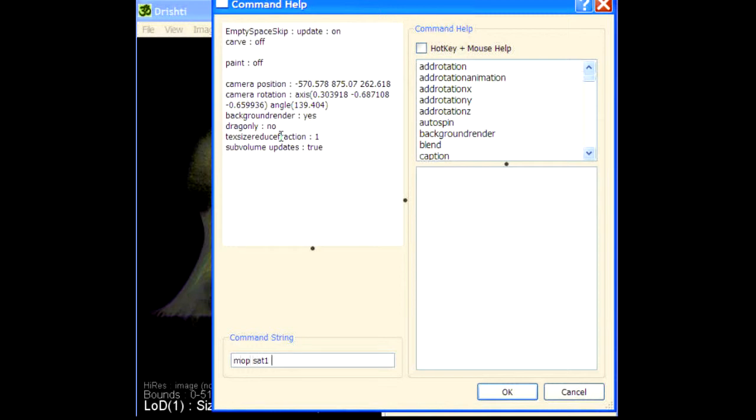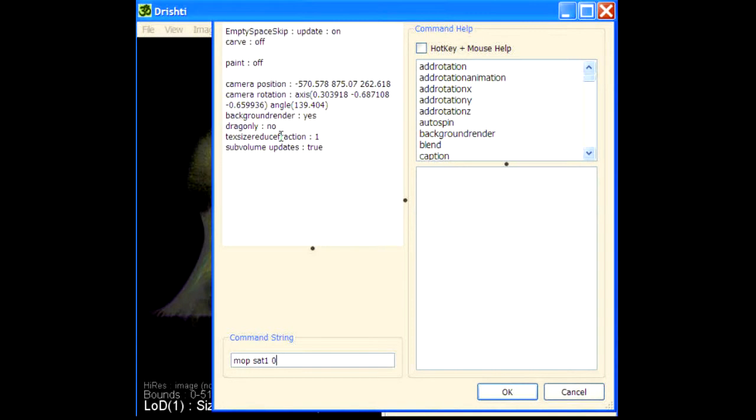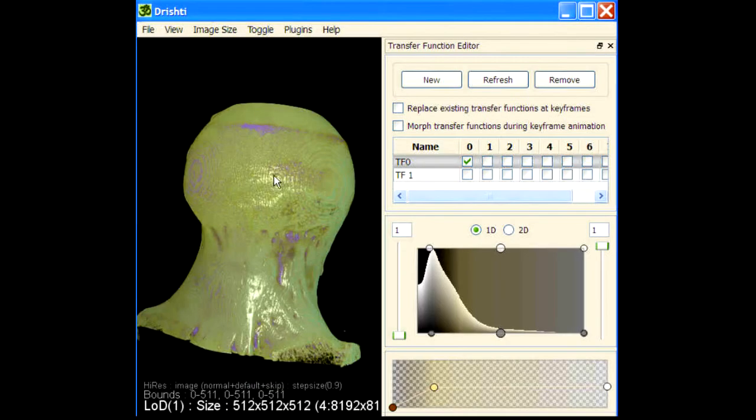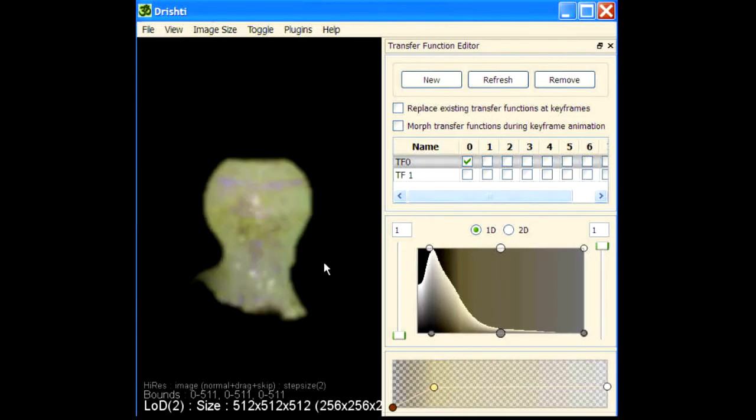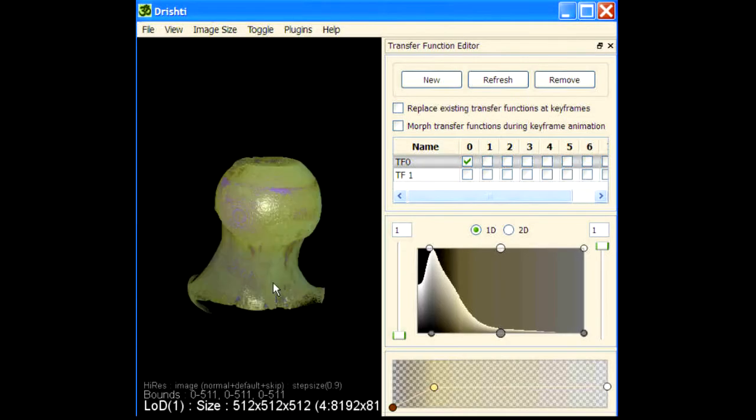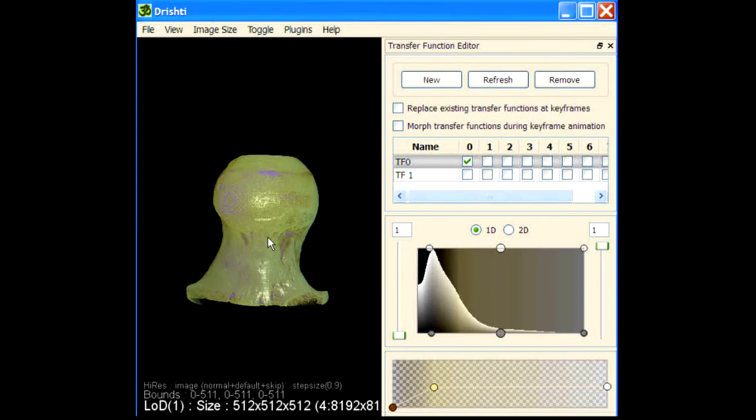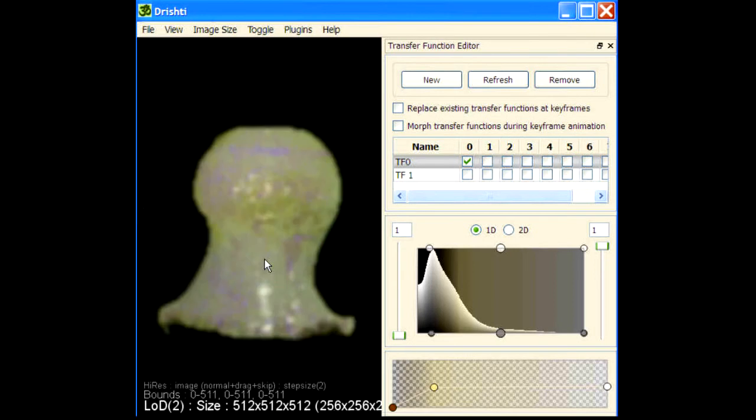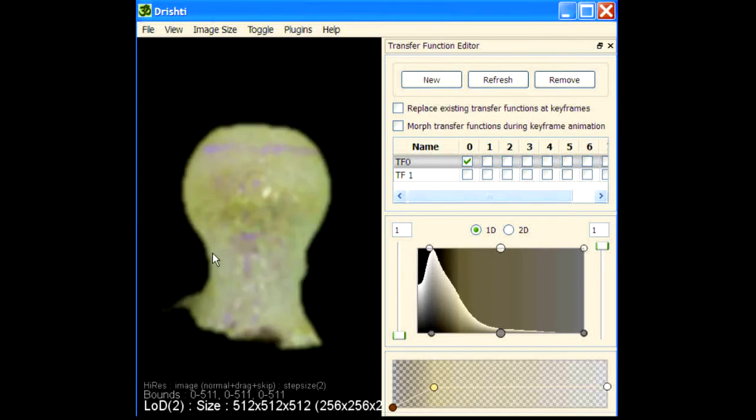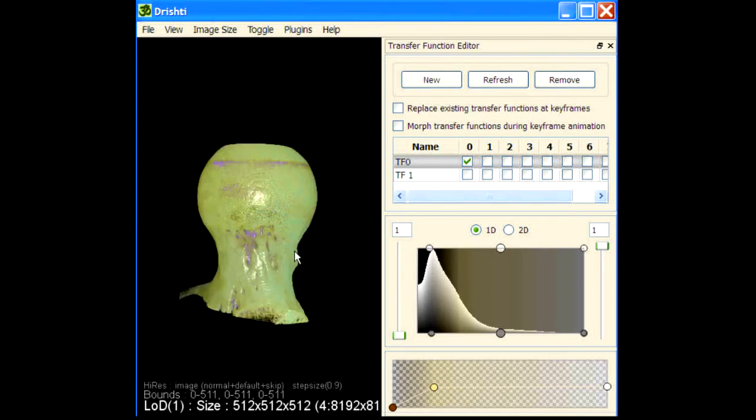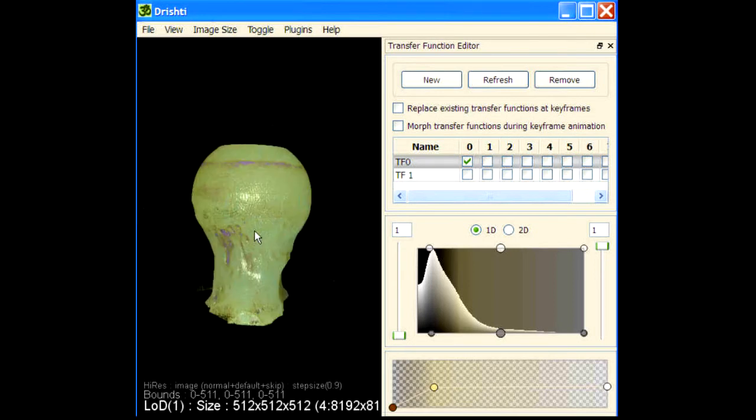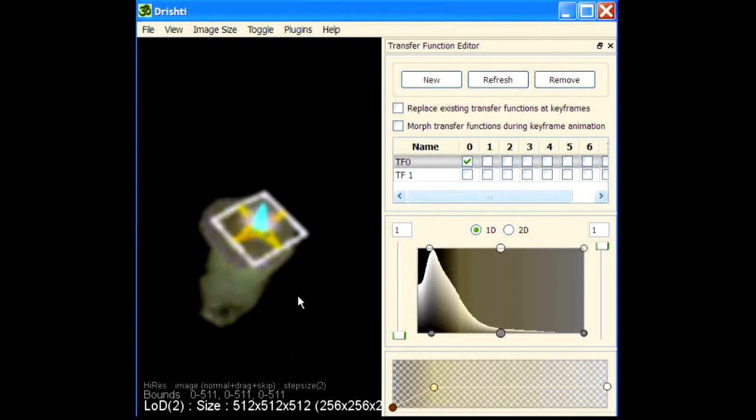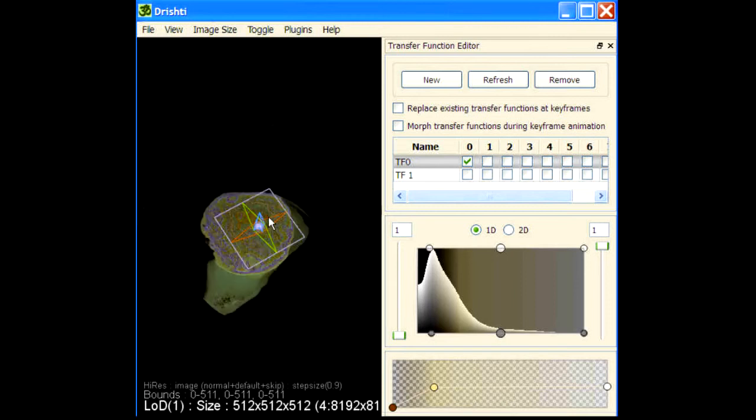Saturate the first channel or the 0 channel to 1 and set anything that is above 0 to 1. So we'll basically get back the original mask values for channel 0 and what we have are these values colored here based on values in channel 2.